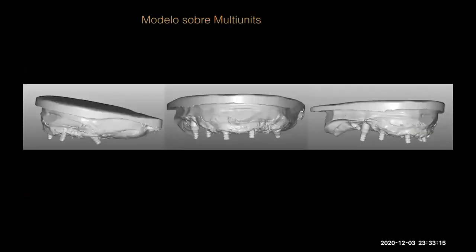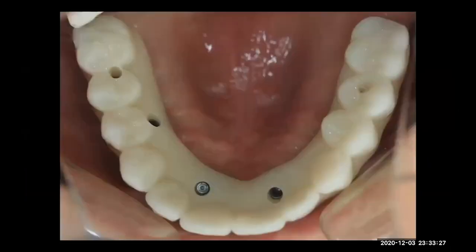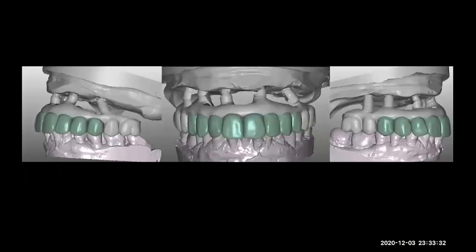So we go back to the lab, we change the plan, we use some multi-units. And now we can see in the software that we can have all our screw holes a little bit palatal. So in that way, we can make a new prototype, send it to the try-in. And once everything is fine, once the patient approves everything, we go to the CAD-CAM again, and we mill the zirconia frame, and we do cuspid to cuspid, premolar to premolar, single Emax crowns.